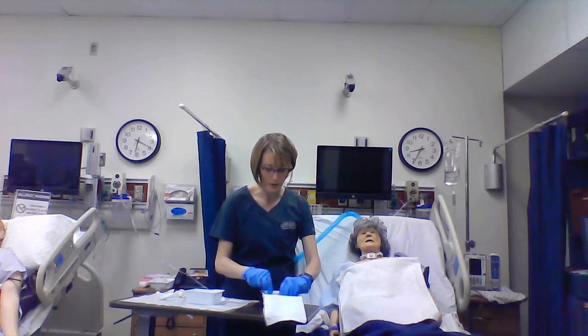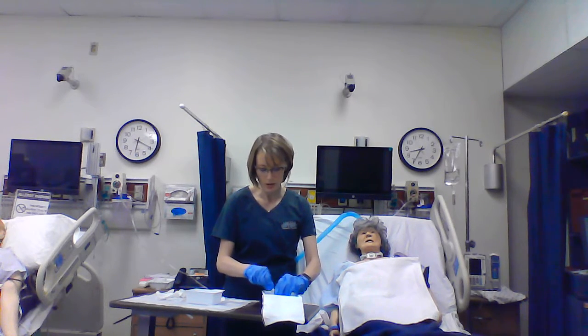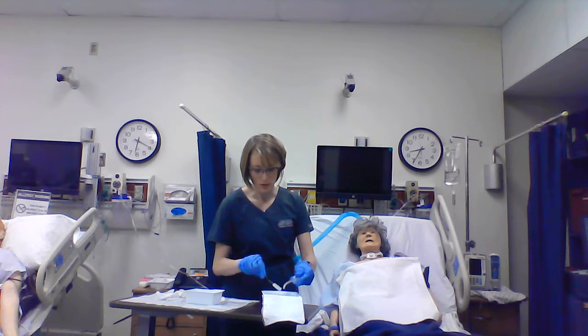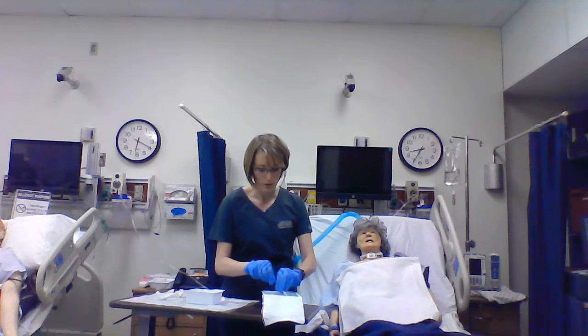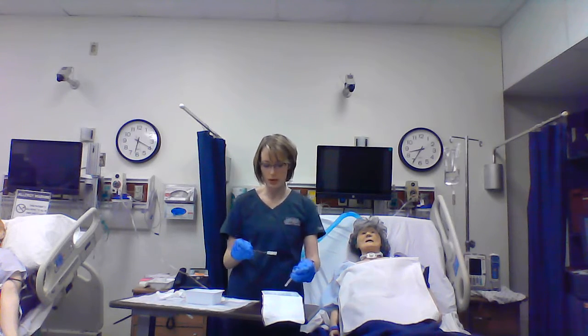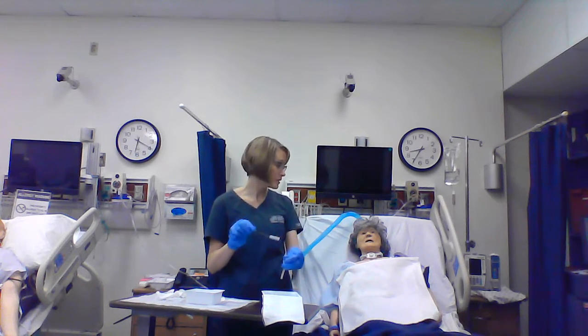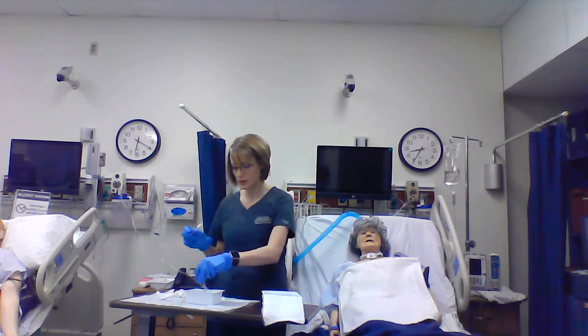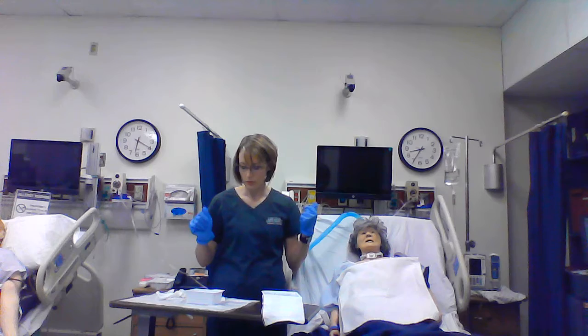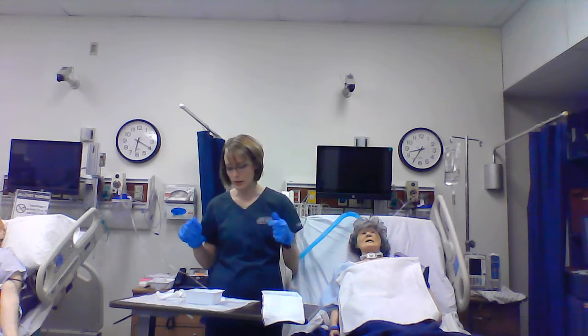So some people do this down within the box. Some people like to do it over a trash can, as long as you're very conscious that you're not flinging secretions all over and contaminating your sterile field. So I'm going to scrub and scrub and scrub, make sure this cannula is nice and clean. Some tracheostomies come with disposable cannulas. You can throw those away and just place a new one in, and you won't have to do this step. Then soak that in regular normal saline, sterile normal saline.